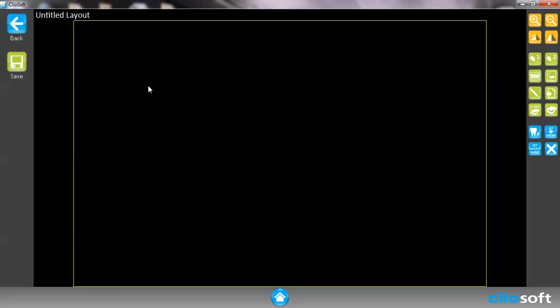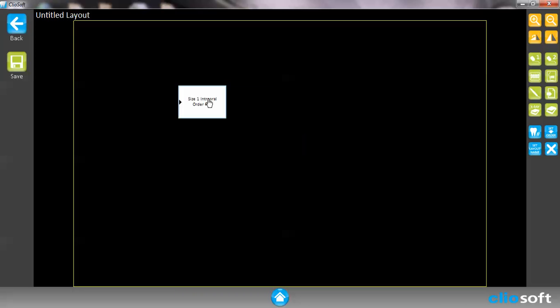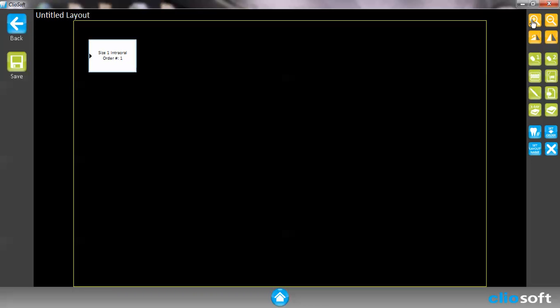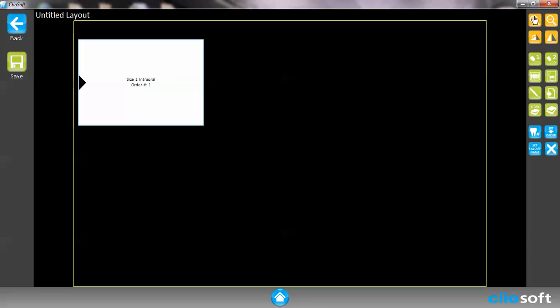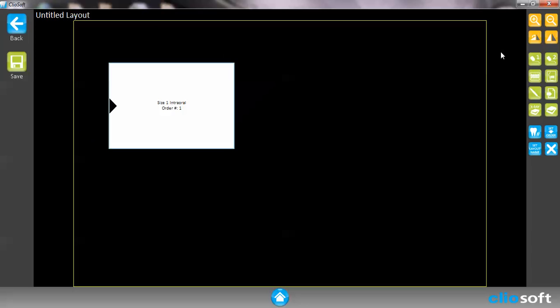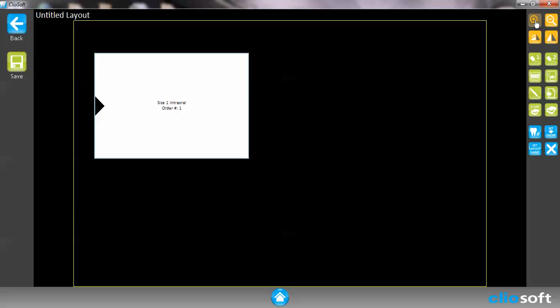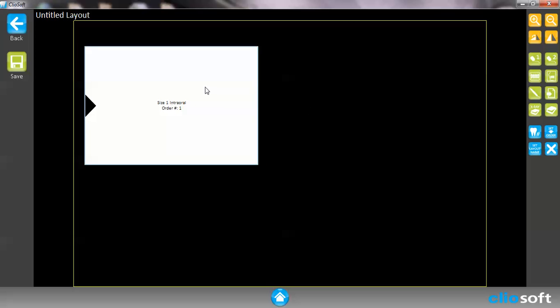Once we click on the new button you'll notice that it's just a blank screen, but on the right side you'll notice that we have all these different placeholders. This one right here is a size one placeholder. We can put that there and we can actually even make it larger than normal. I keep hitting the enlargement button. We can make a single x-ray image very large.